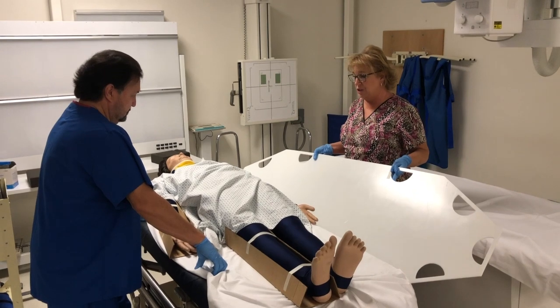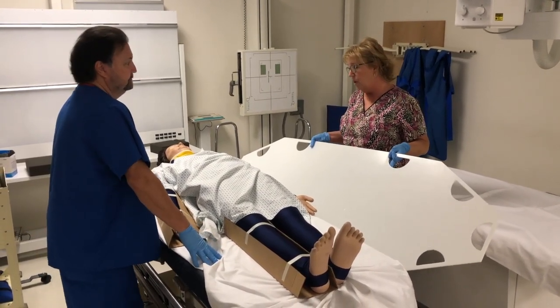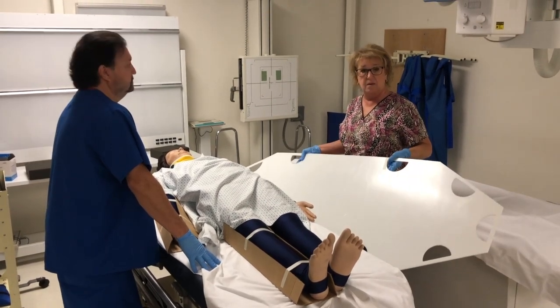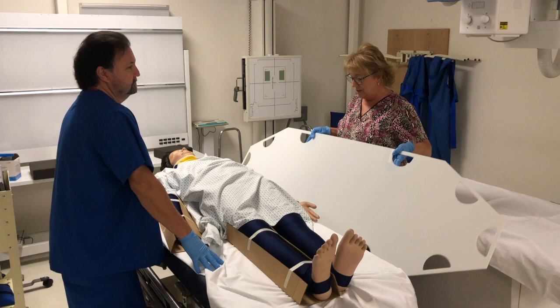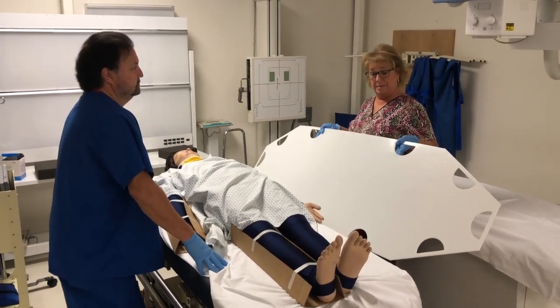And like I mentioned, normally in a move like this we would have 2 to 3 people, 1 at the head and 2 on that side, but we are a quarantined family, and so I just have my husband.